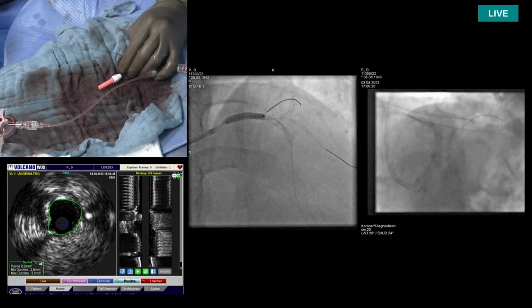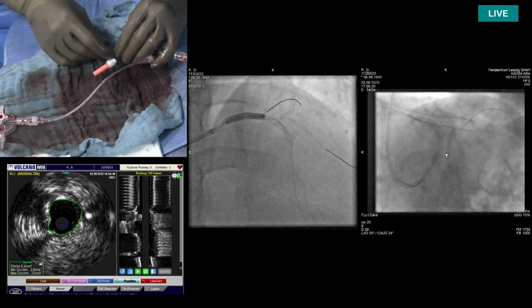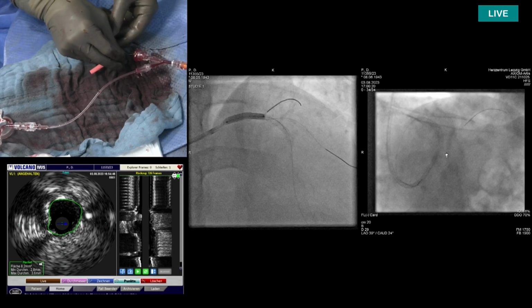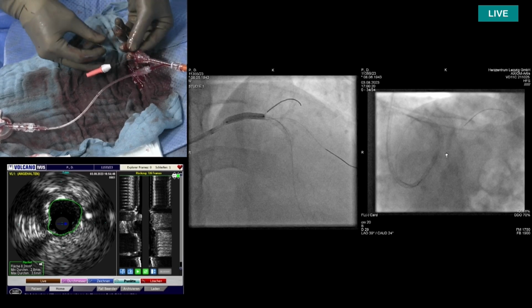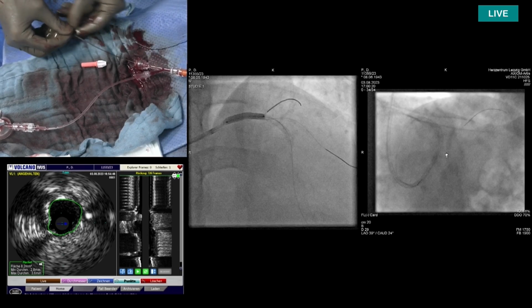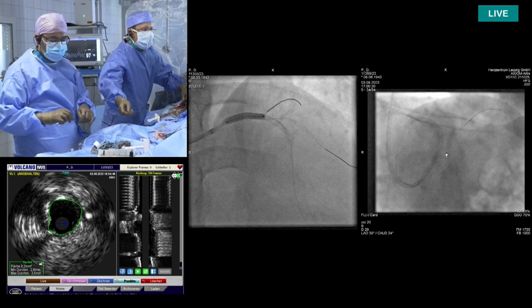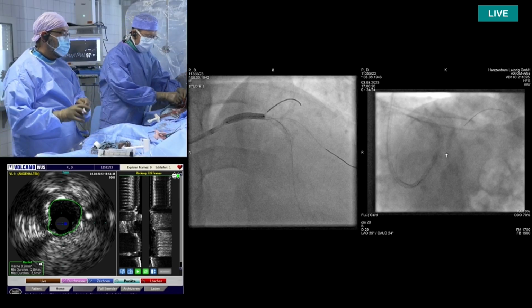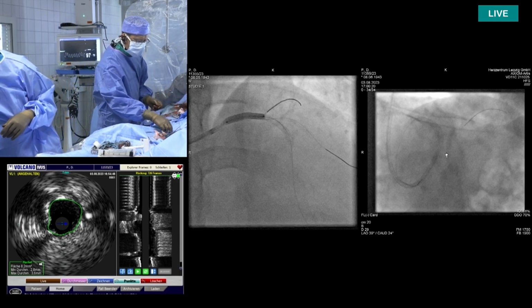Yeah, we actually use it also in a rare situation of chimney stenting. Like if you do TAVI and you need a chimney stent, that's currently in Europe, I think, the most used stent for this because of the additional radial force. Yeah, there are more connectors proximally. You mean for chimney stenting after TAVR, if you need to protect the artery? Yes. It has a good radial force.